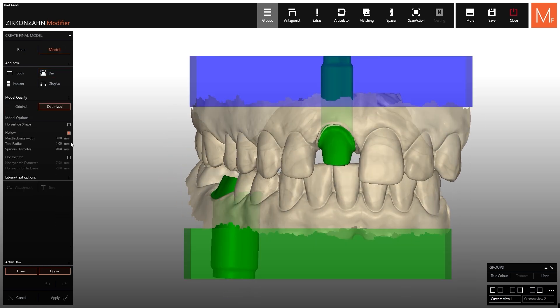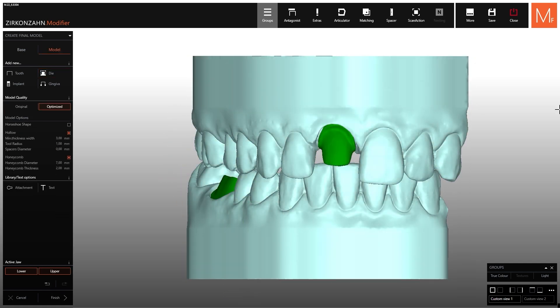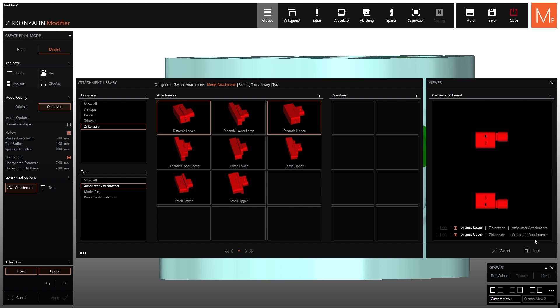Once you have created the models in the Model Maker module of the Zirconzon modifier software, you can proceed with the printing.